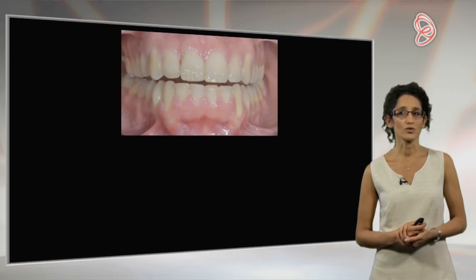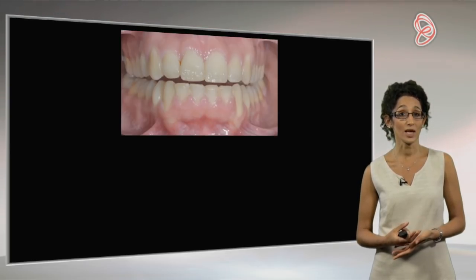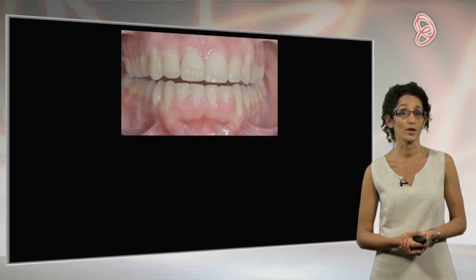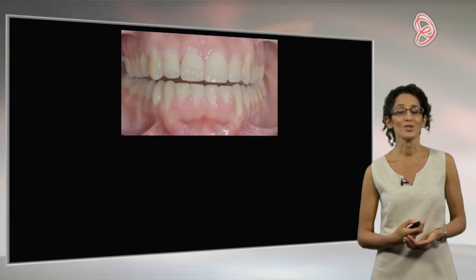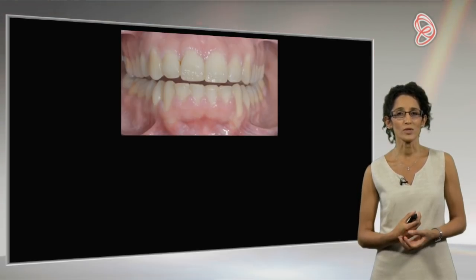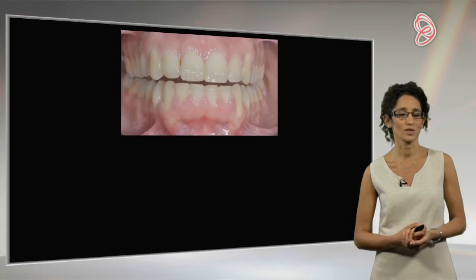So if we just look at the intraoral view once his orthodontics is finished off, you can see his teeth have been beautifully straightened. An issue with his lower canines there, a little bit buccal in the arch. Tissue is very thin. We need to be careful about recession there. But again, you can see how thick those tissues are around the lower incisors. And also note the papillae as well, how flabby and wide they are. That's something that will be prone to periodontitis or pocketing down the line when the tissues are that thick.